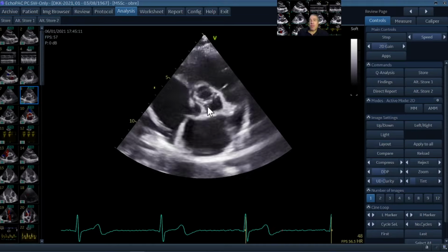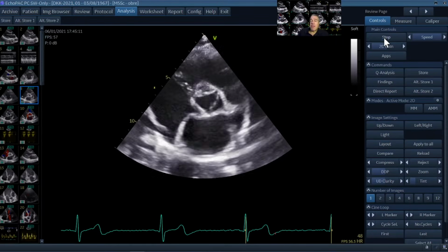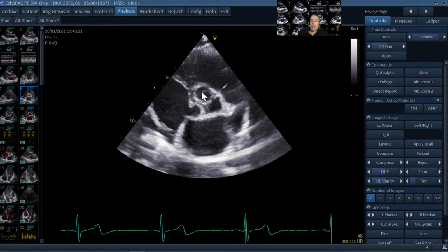And if you focus on the aortic valve, again I stop it, you see that there are three cusps. You have here the rim, like a star configuration, the Mercedes star as we typically call it, at least in Germany, where the Mercedes cars are produced. We have three cusps, one here, and one here. And how are these cusps identified? Well, this is the right ventricle. This is the right ventricular outflow tract. And these cusps are related to the coronary arteries.